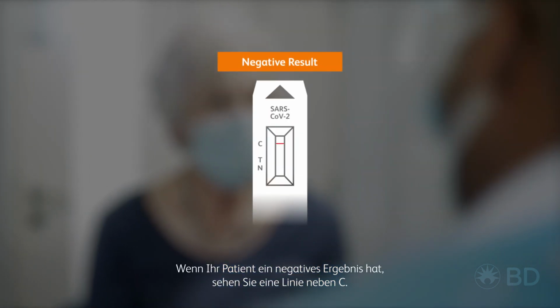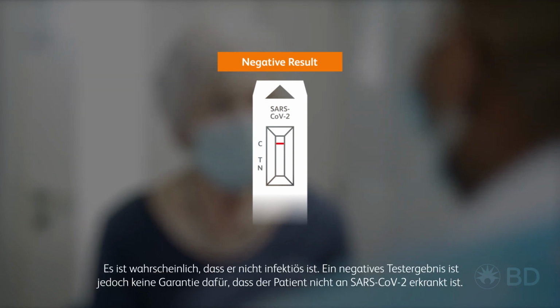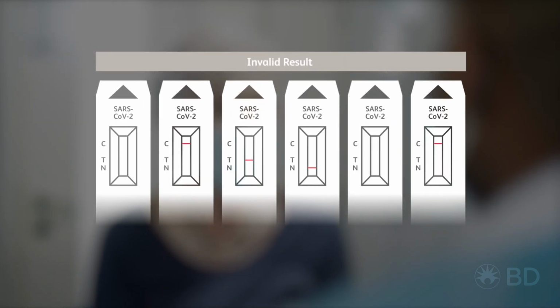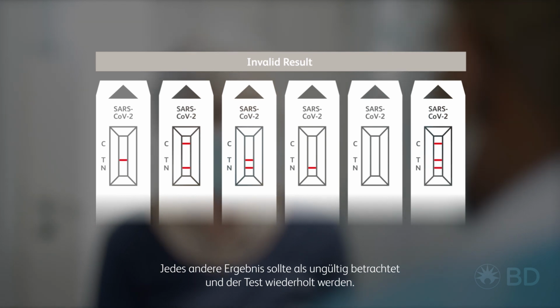If your patient has a negative result, you will see 1 line next to C. It is likely that they are not infectious. However, a negative test result is not a guarantee that they don't have SARS-CoV-2. Any other result should be considered invalid and the test repeated.